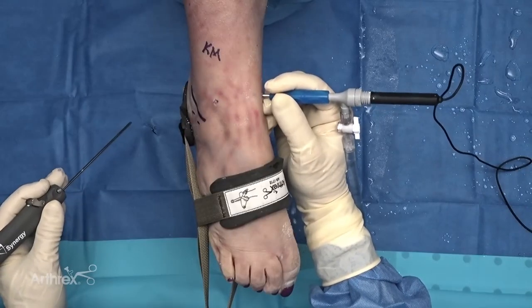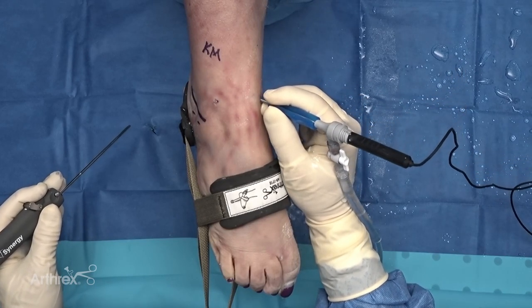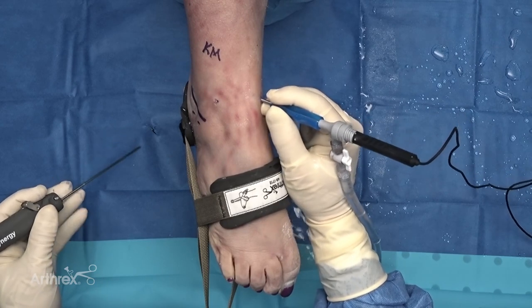The pencil grip really allows the surgeon ultimate control. As you can see, my hand is rested — I'm resting on the ankle — and having my muscles relaxed allows more control and prevents surgeon fatigue over a long case.